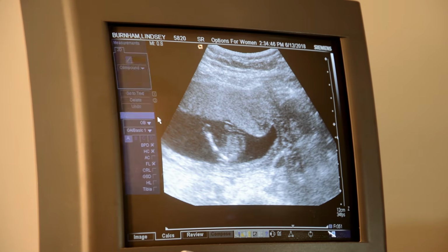So we'll see. You're going to get another ultrasound again? Well, when they determine the sex. Yeah. What, it's normally at 19 weeks or something like that? Well, normally you can see like 16, 17 weeks. 15, this is close. I mean, there's definitely something there. So I'm thinking a boy.